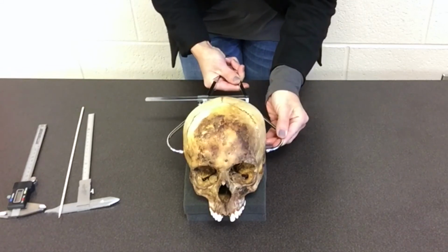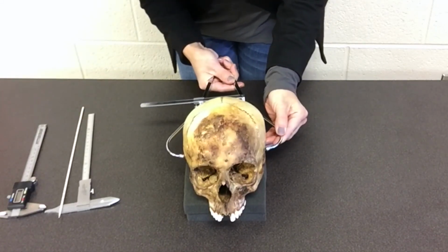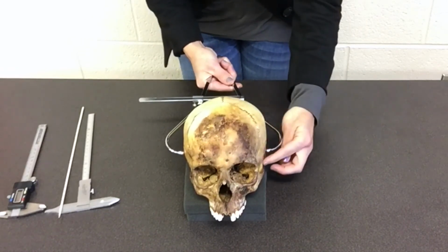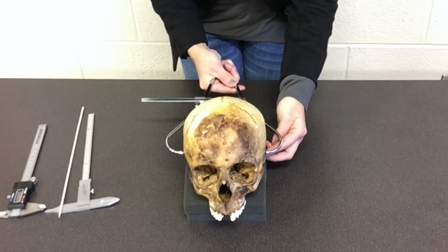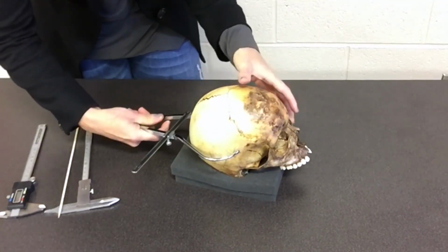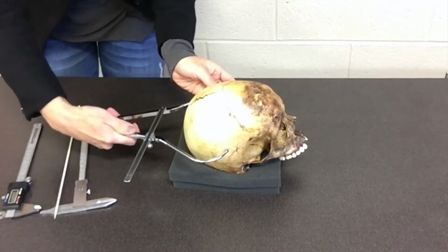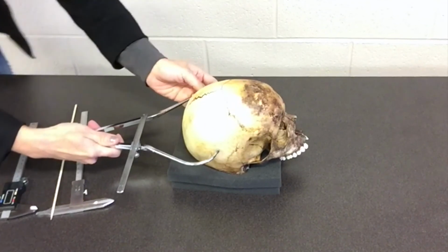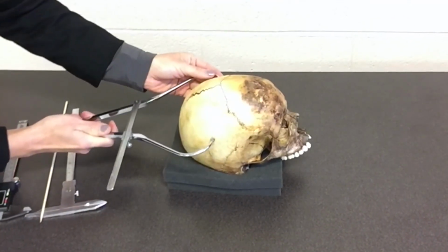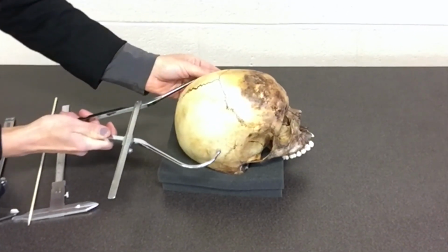You may also find the measurement on the temporal bone. If this is the case, you just want to steer clear of the supramastoid crest or the suprameatal crest as you're obtaining that measurement. So I'll demonstrate it from the side so you can see the areas where I'm trying to avoid. Here, if it's on the parietal bone, you just want to be mindful of the temporal line, so you don't want to be up there.